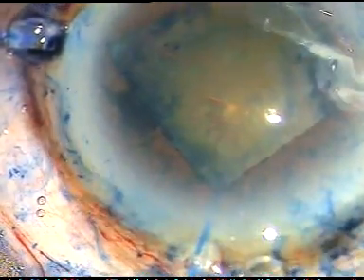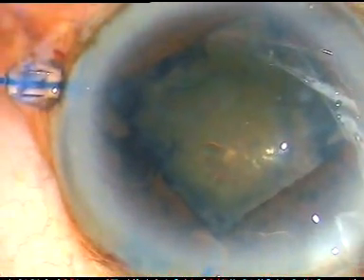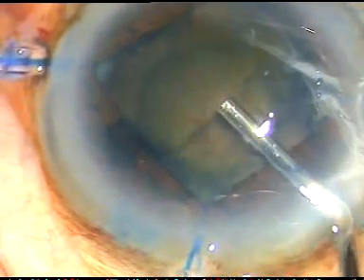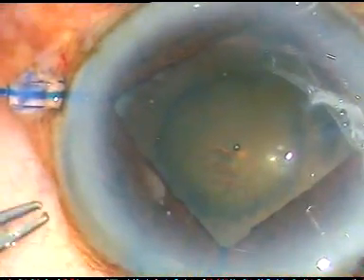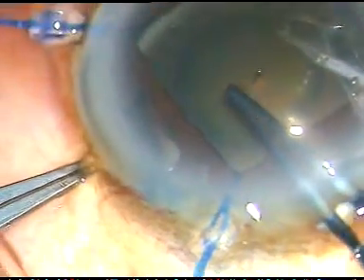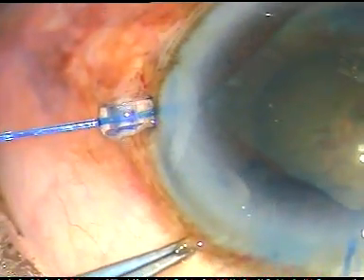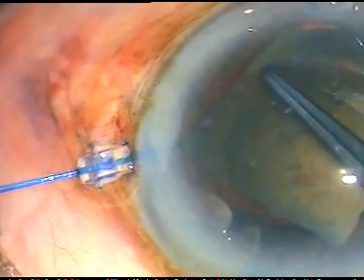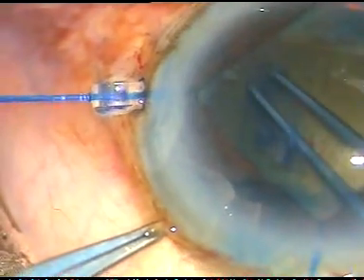My subsequent steps will be very easy. I am washing the ocular surface for better visibility. This is viscoelastic substance, HPMC. Now I take the Utrata forceps and do the CCC very gently. We cannot pull very fast or make jerky movements — we have to make very gradual and gentle movements when the zonule is weak.